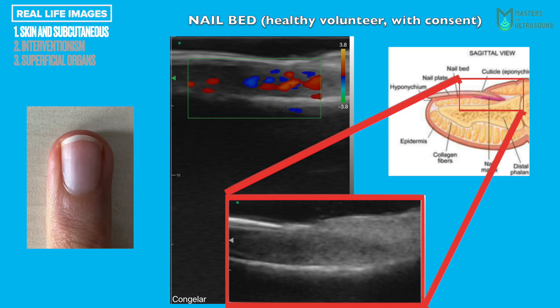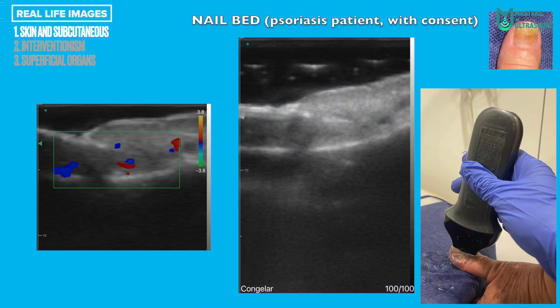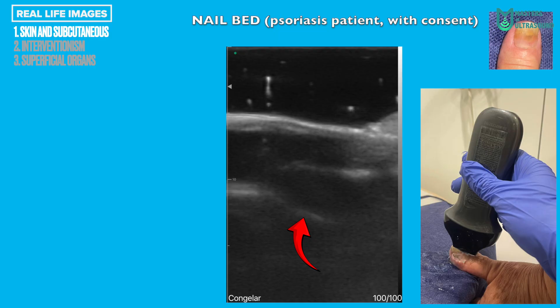Then, a healthy nail bed — have a look at the B mode in the red box and how the different parts can be seen. Remember this image when we compare to that of a real patient. Now, an ungual psoriasis patient. Note the thickened irregular nail plate and the loss of normal layered appearance. The red arrow is pointing to the hypoechoic nail matrix — not the first hypoechoic zone, which is just gel.